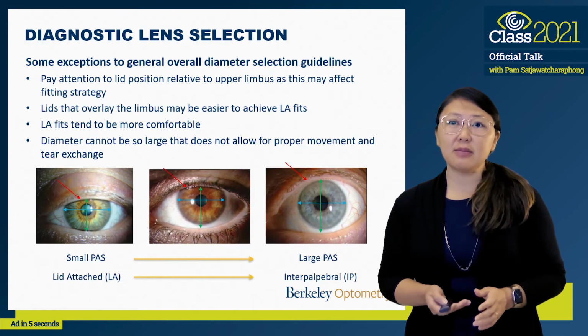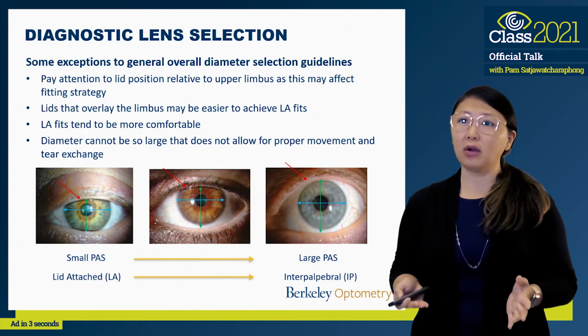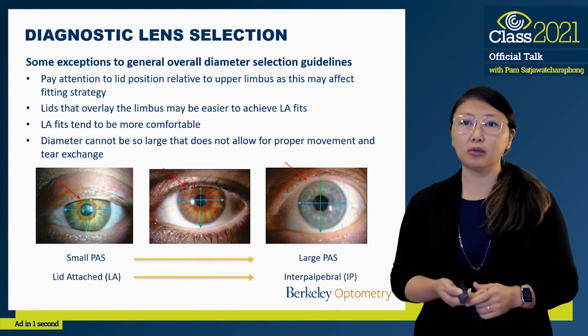Now, there are some exceptions, I find, to this overall diameter general rule.